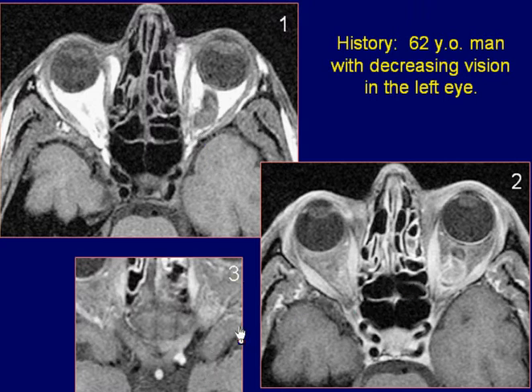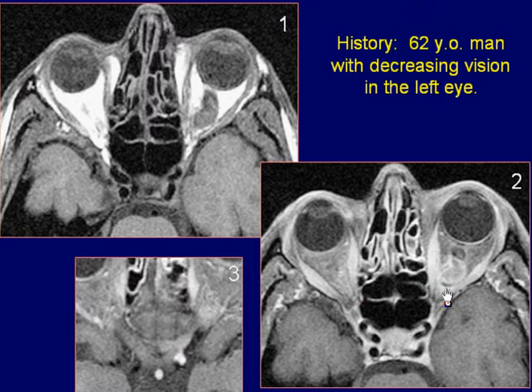Axial post-GAD fat saturation T1-weighted images of the orbit demonstrate the left optic nerve mass lesion as a heterogeneously enhancing area with posterior extension to the left side of the optic chiasm.